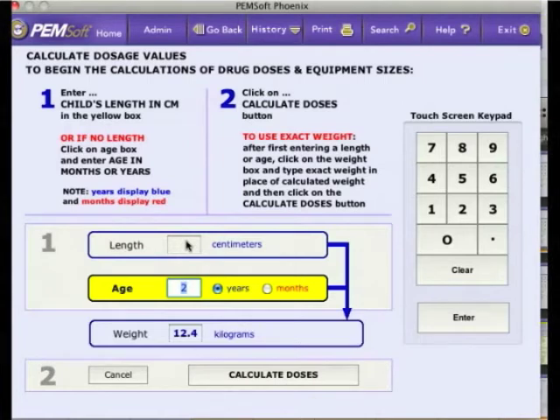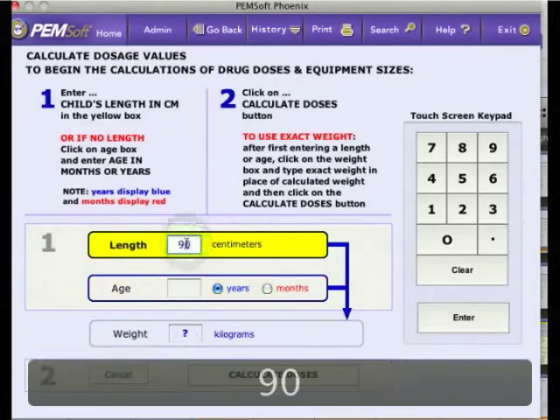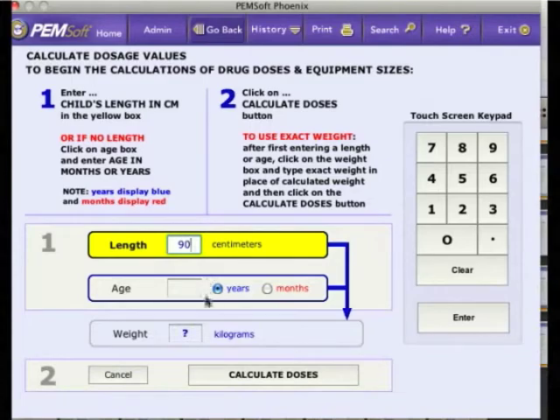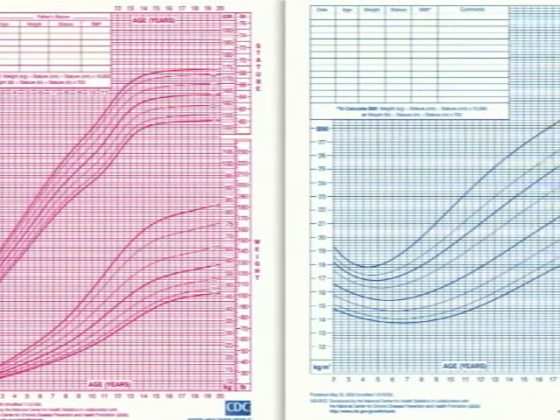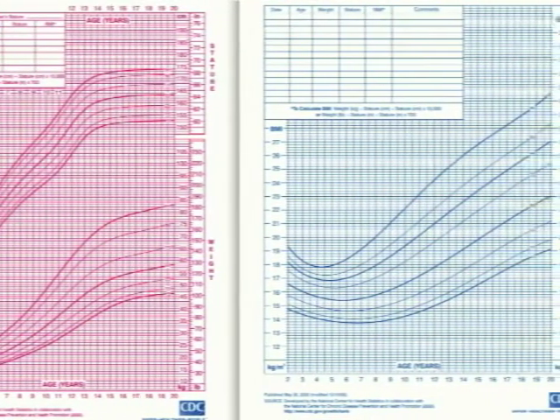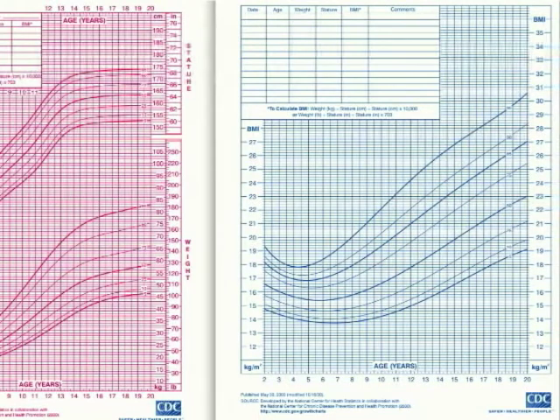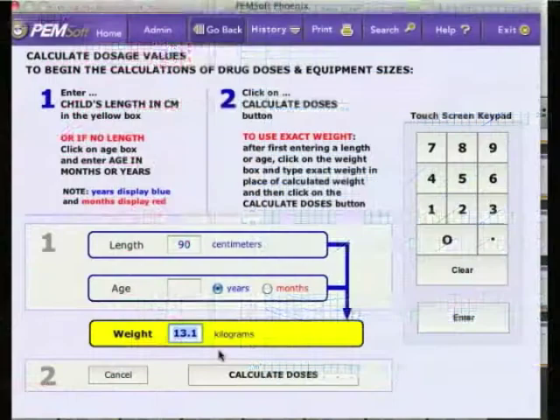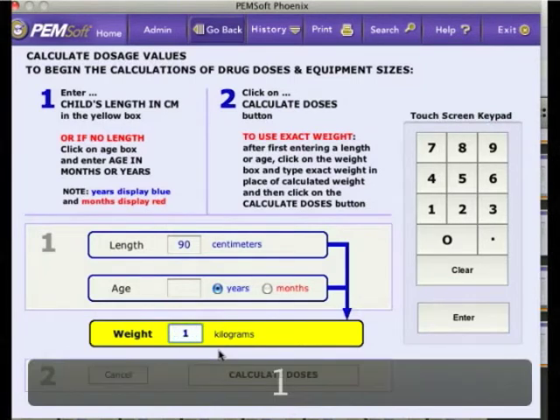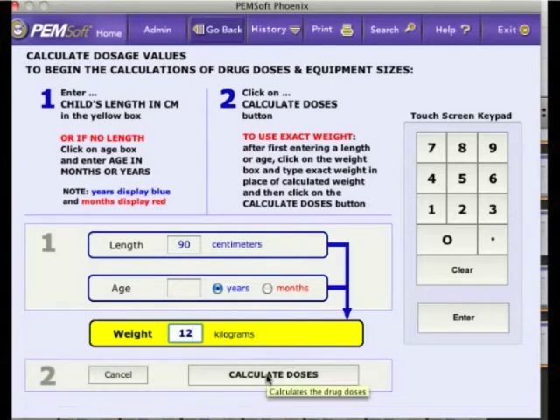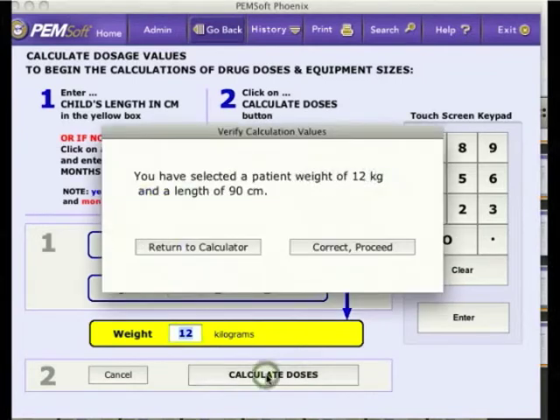As an example, let's use 90 cm as the patient's length. After entering either the patient's length or age, Phoenix generates a mean weight based upon the Center for Disease Control's 50th percentile charts. Alternatively, you may overwrite this estimate and enter the actual measured body weight or a better weight estimate. Let's adjust this to 12 kg.